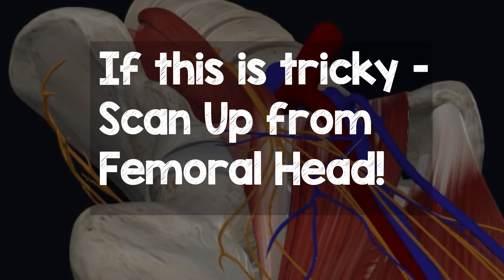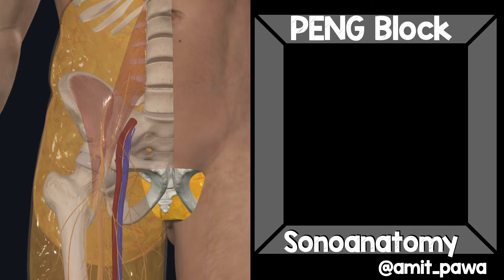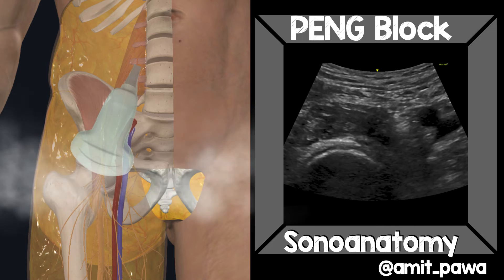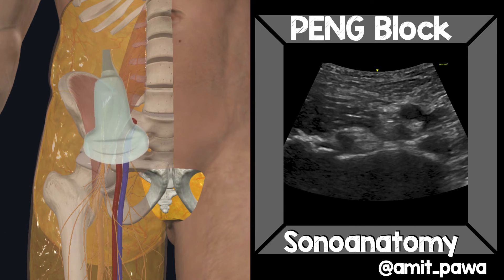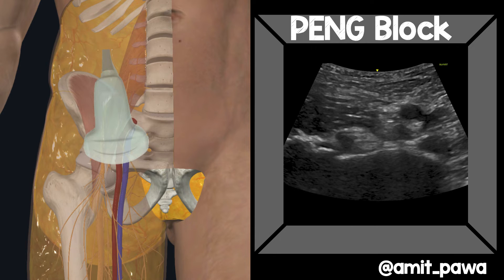Sometimes people find it difficult to trace down from the anterior superior iliac spine — this can be tricky. My favourite approach is to scan from the femoral head instead. Place the probe on the femoral head and slide cranially; you'll come up onto the anterior inferior iliac spine and the pubic ramus, and can hopefully identify that bright white psoas tendon lying just on the iliopubic eminence.